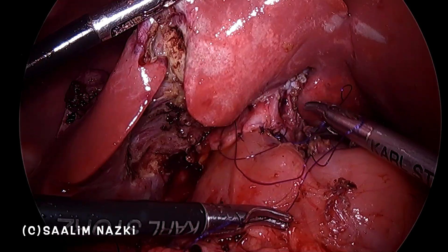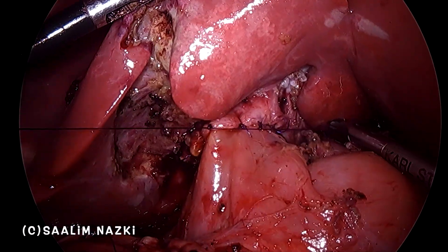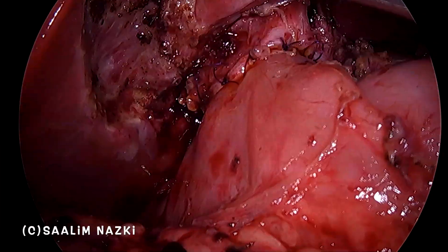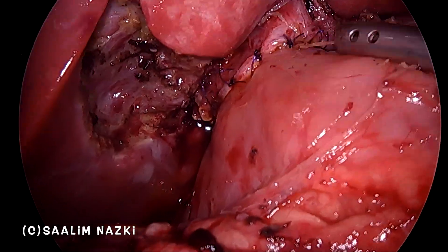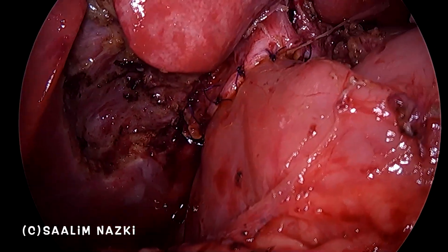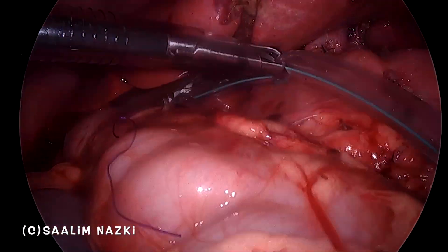Once the suturing is completed, this is the final look of the anastomosis. It should look like this, and we have kept a drain in this case for three days.